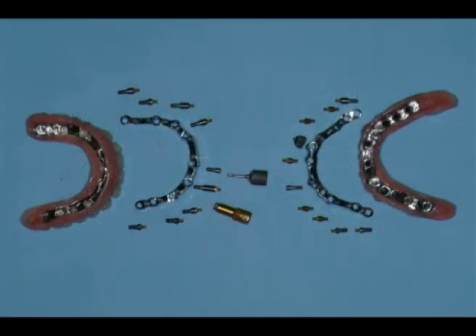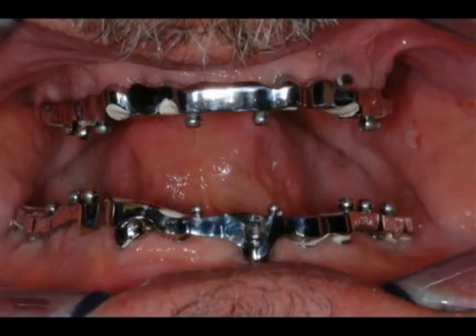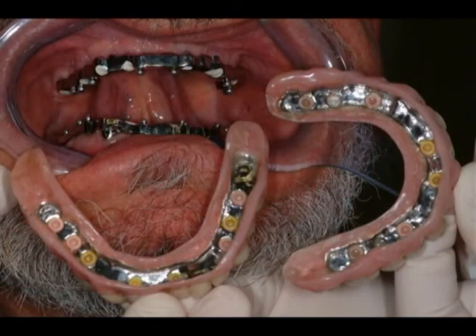Finished upper and lower prostheses. Components analysis. Upper and lower bar connection between every implant. Two dentures with annular blocks, passively retained, double structured. Connecting bars with annular blocks and spherical OT cap attachments cemented onto implants. Removable dentures with cast structures and retentive caps of different colors and retentions inserted into metal boxes.